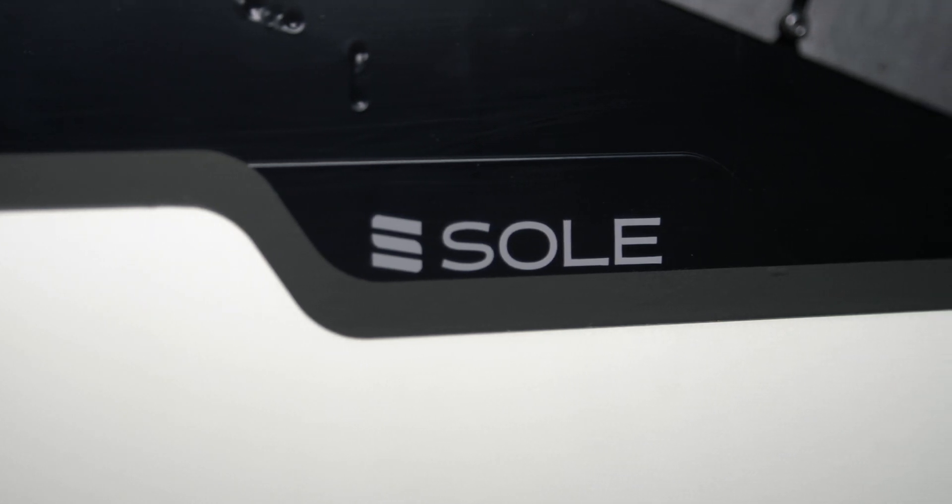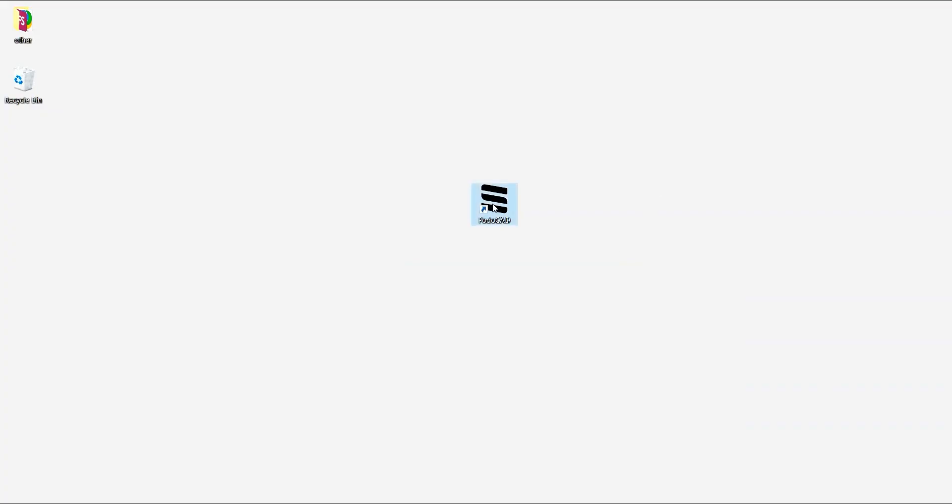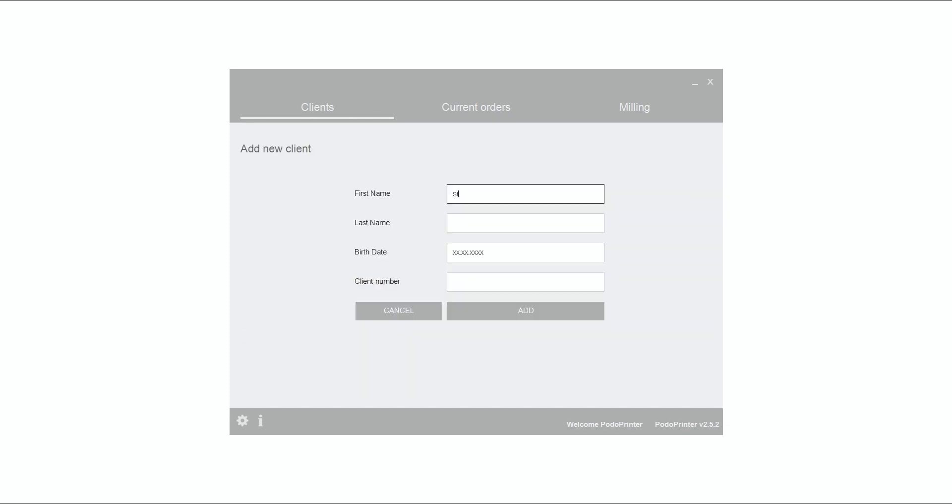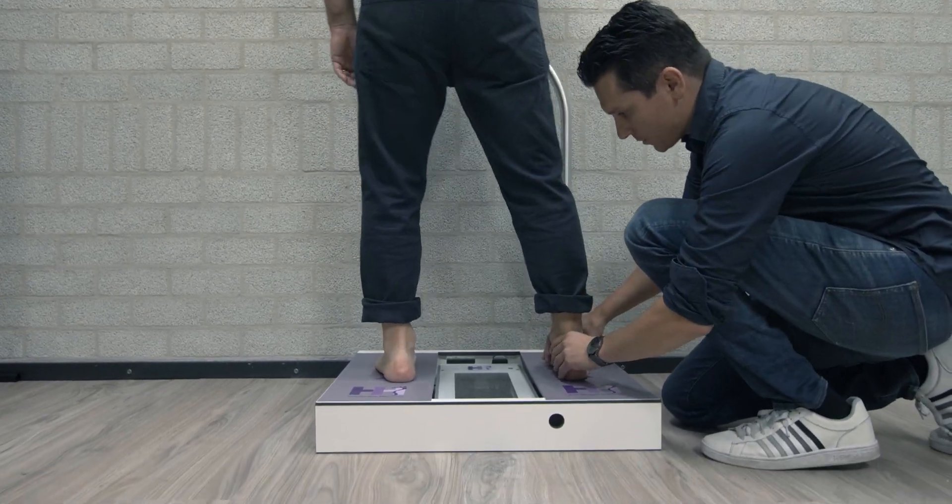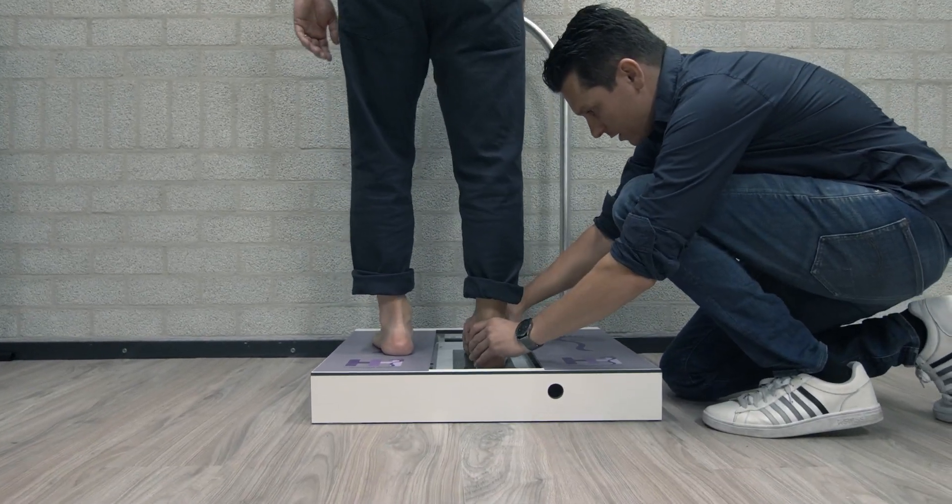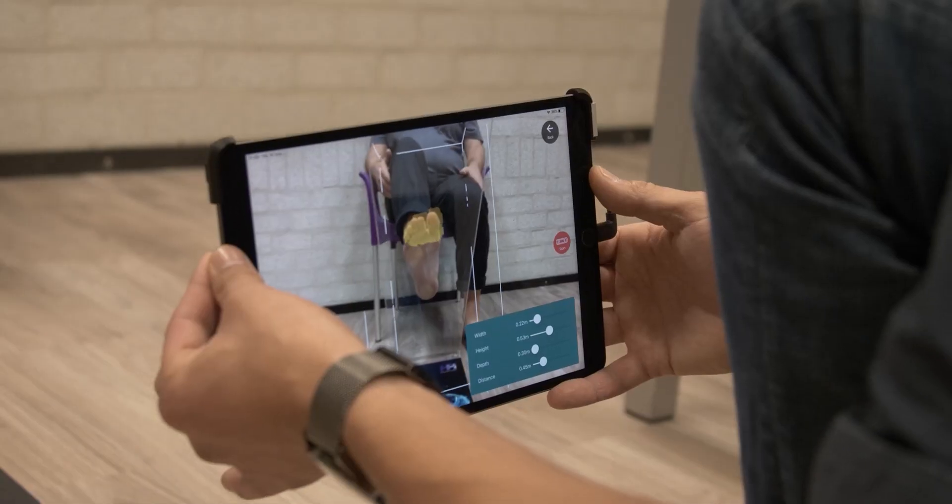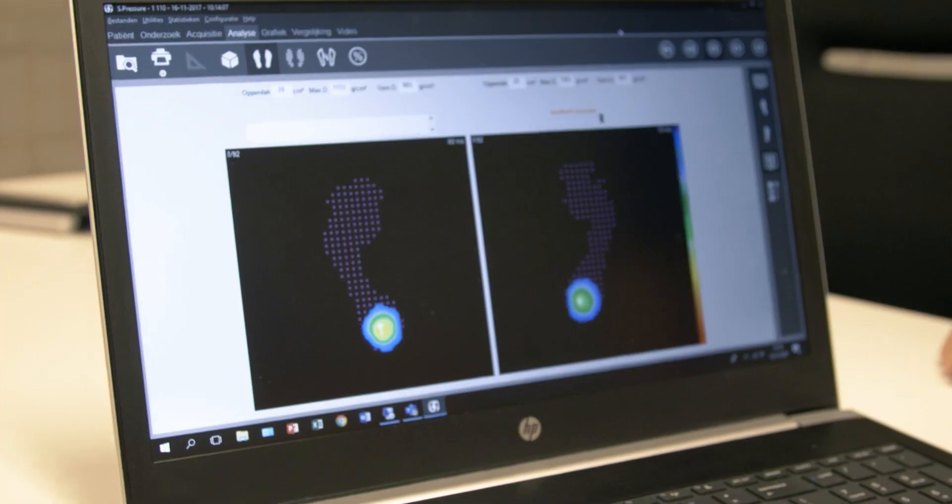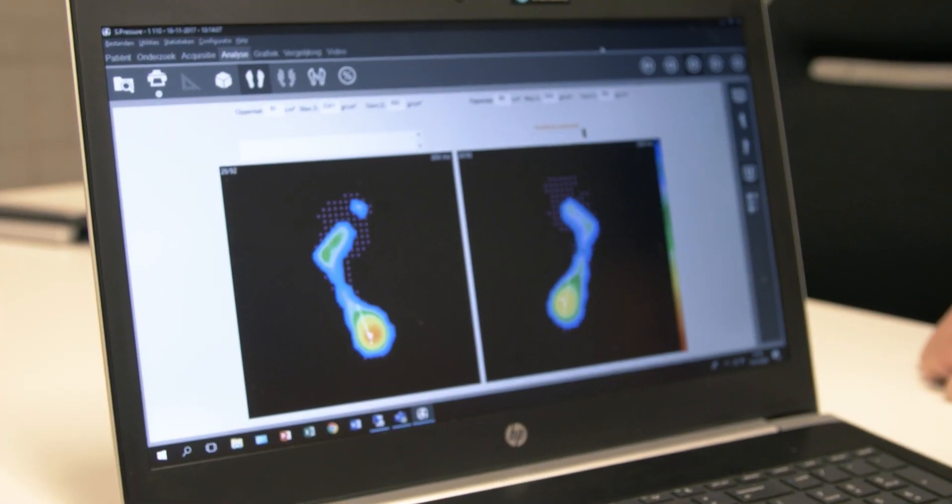The Sol Podo printer comes along with PodoCAD, our all-in-one software solution. You start by adding a client into the database and load their 3D scans. A wide range of common scanning technologies can be applied here.